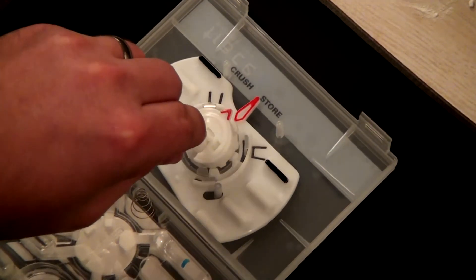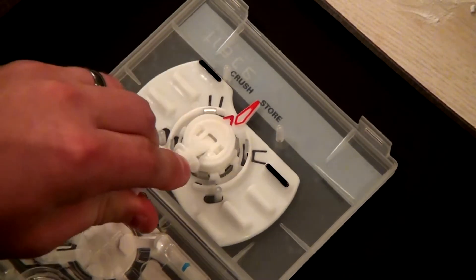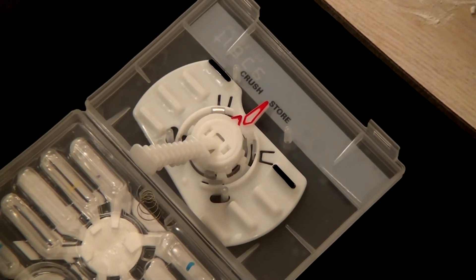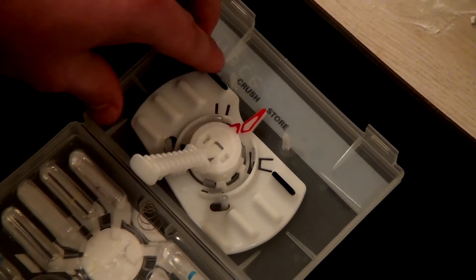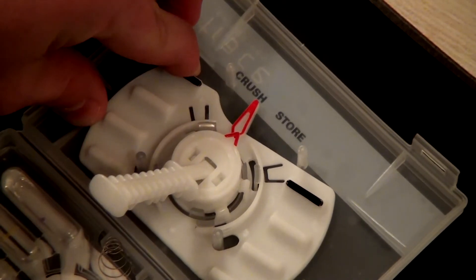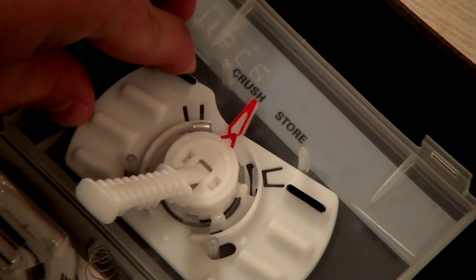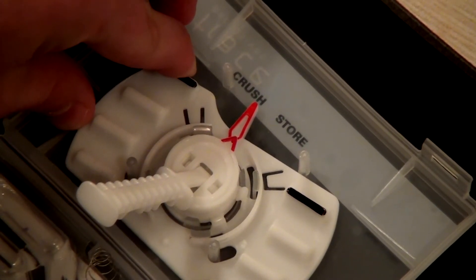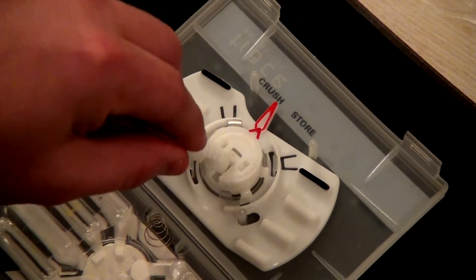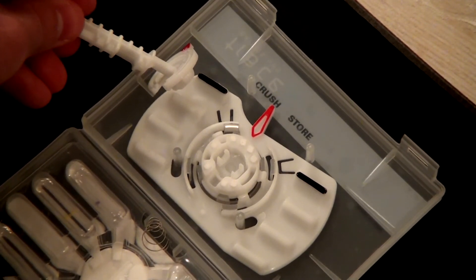Step 5: holding the collector, align the red pointers on the collector and the crusher and snap the collector into the crusher on the lid of the case. Release the handle. Step 6: push the black ribs on the crusher to rotate the red arrow on the crusher away from store and towards crush. The red arrow on the collector is now pointing straight up, while the red arrow on the crusher is pointing toward crush. Step 7: detach the handle and cover from the collector by pulling the handle sideways. The crusher and collector body stay in place while the handle and cover are removed. Dispose of the handle and cover.